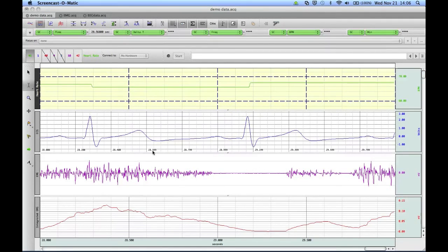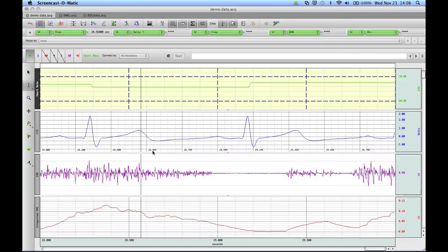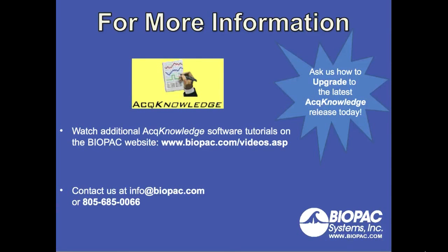These are some of the main features of the Grid functionality in AcKnowledge. For more information, you can watch additional AcKnowledge software tutorials on our website or contact us at info@biopac.com or 805-685-0066.